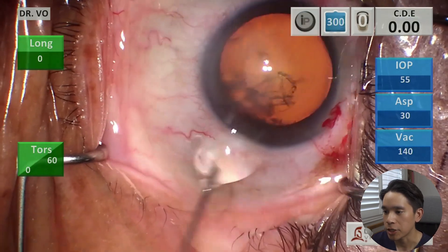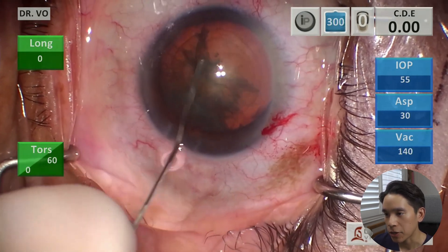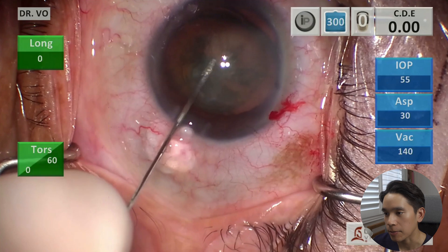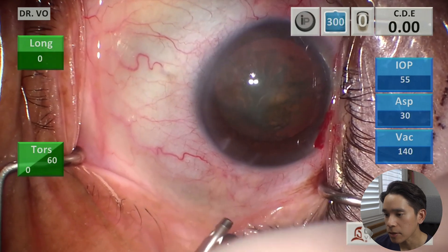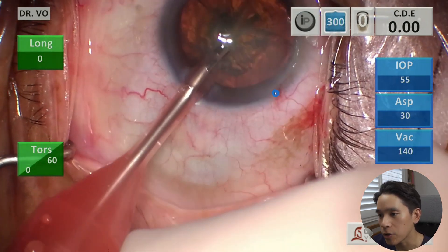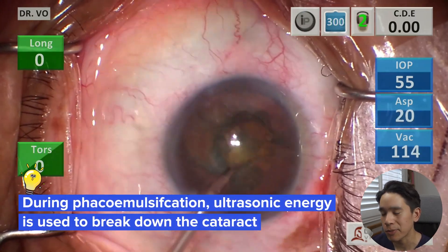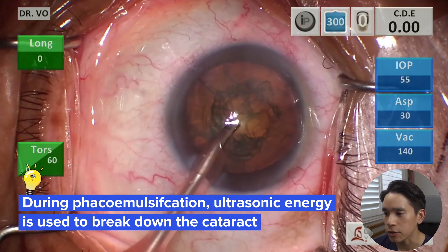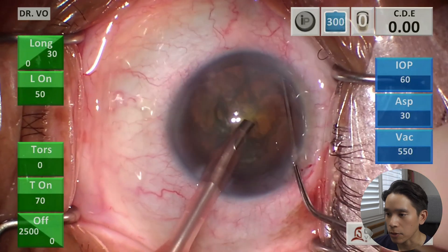At this step, I'm going to be injecting some fluid into the eye, and this is to help free up the cataract from the capsule. We want to make sure that the cataract itself is well mobilized and free from any sort of attachment to the capsule so that when we suction the cataract out, we're able to remove it easily. This step is the most important step — this is where the cataract is actually removed. Here I'm using an instrument called a phaco probe. Phaco stands for phacoemulsification. This instrument is similar to what they use in dental offices for scaling — it uses ultrasonic vibrations to break down the cataract, and then it also suctions up the bits of the cataract. That's how we're able to remove it.